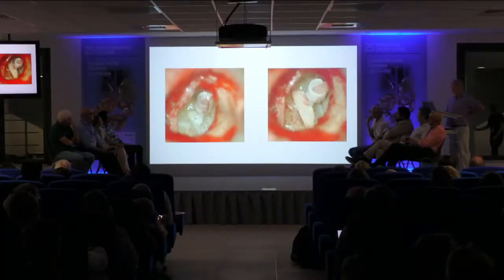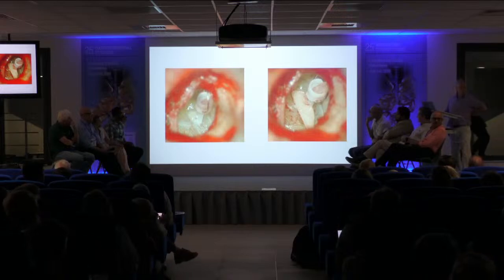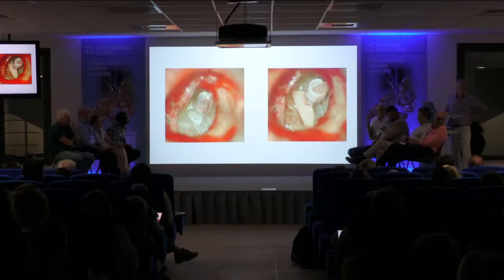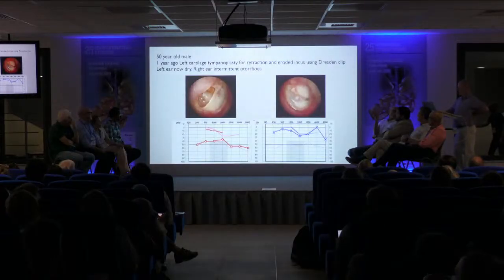This is what I did. I put a bucket handle underneath with a little bit of cartilage stabilizer. Just out of interest, that was made by Richard, and they don't make it anymore. So you can't do that. They make a titanium one, which is not as good. Okay.